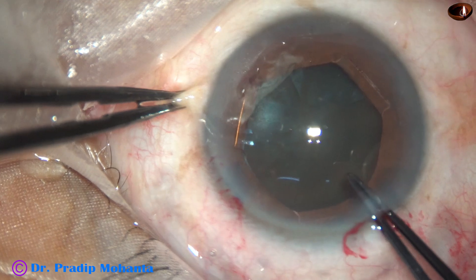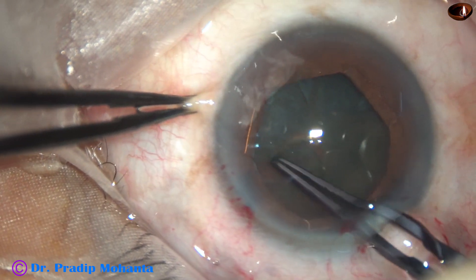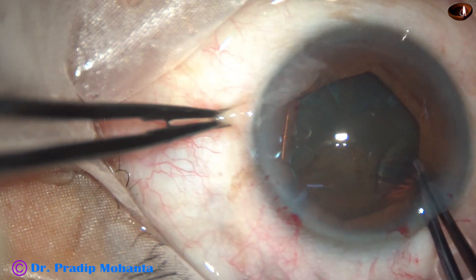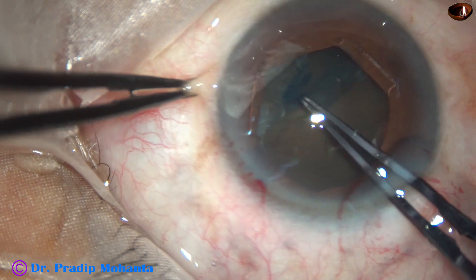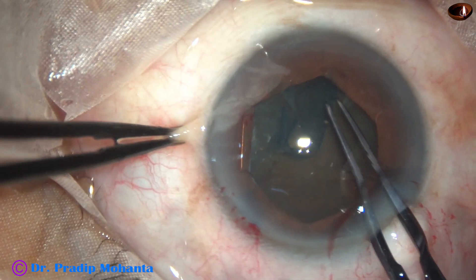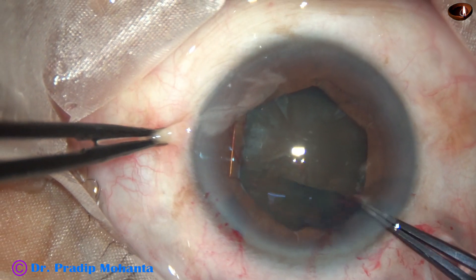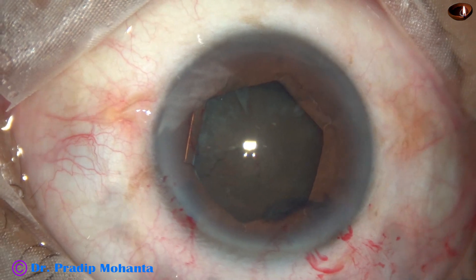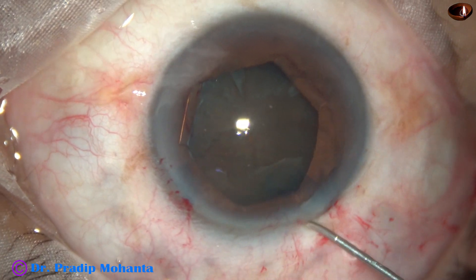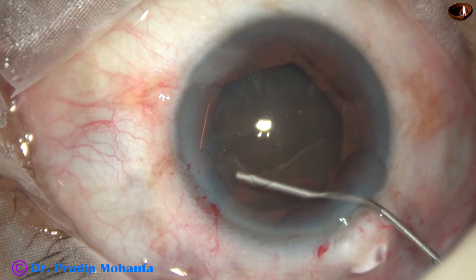Capsulorhexis is now done. The size of the pupil is now about 5.5 mm, and I am getting a rhexis of 5.5 mm going underneath the iris at some places. Since the cataract is hard, I deliberately did this large rhexis.